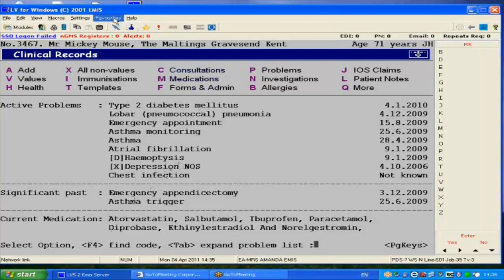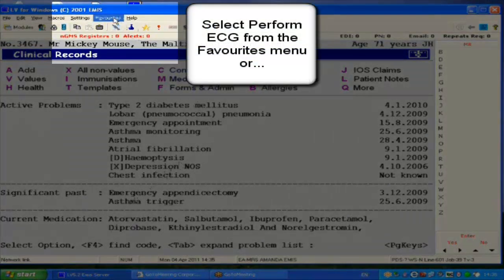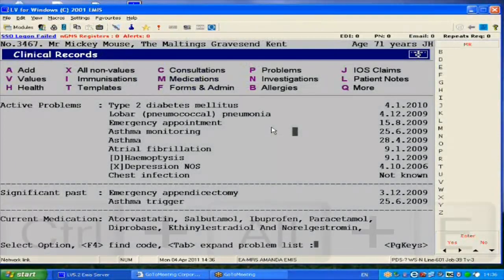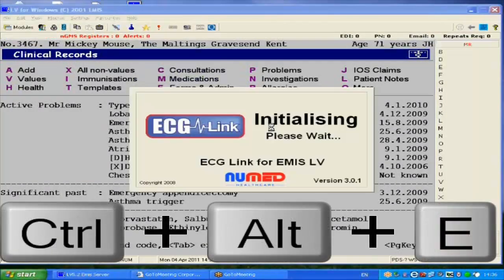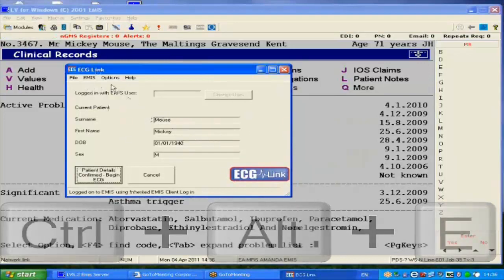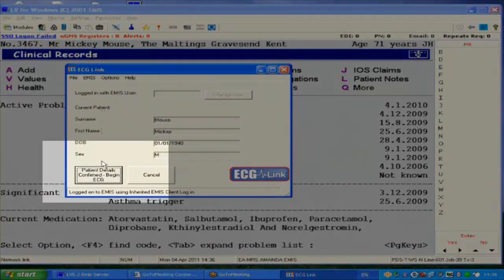You now need to go back into the medical record of the patient. Press Ctrl, Alt and E on the keyboard simultaneously. This will open up the ECG link software. All data is imported from the patient record into the appropriate fields. We now press the confirmation button and the ECG software will automatically open.